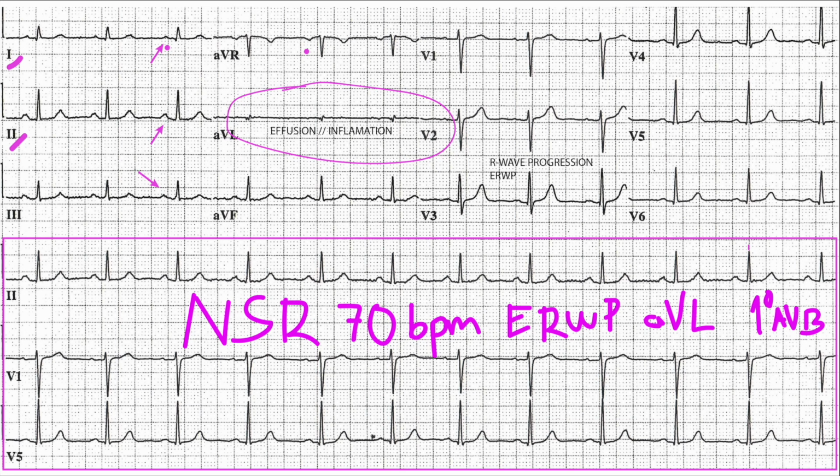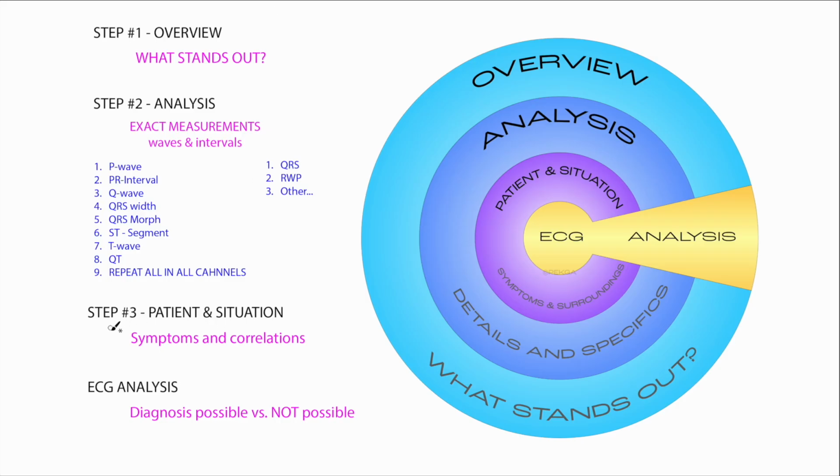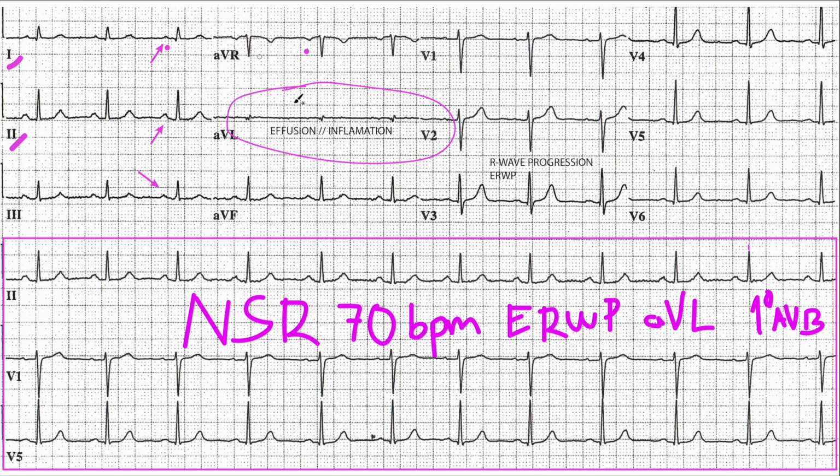So when it comes to the method that you are using, whatever the method is, do not exclude what's going on with the patient. All three of these steps in combination will allow you to make an ECG analysis, which will make the physician's job easier at diagnosing what's really going on, right? So ECG is just one of the tools that's being used in a complete diagnosis. This patient might have come in for, I don't know, a broken foot, and the ECG showed an issue. So, deep dive. I think that should about cover it.